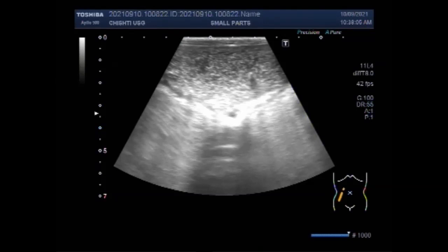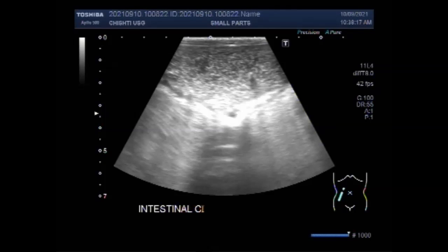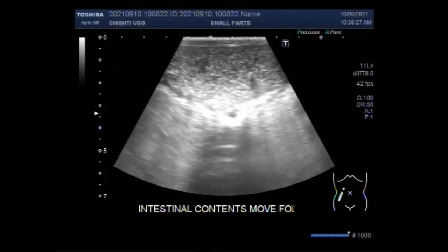Again, you can see the gut movements — the intestinal contents are moving. The intestinal contents move forward, but due to the blockage they come back.